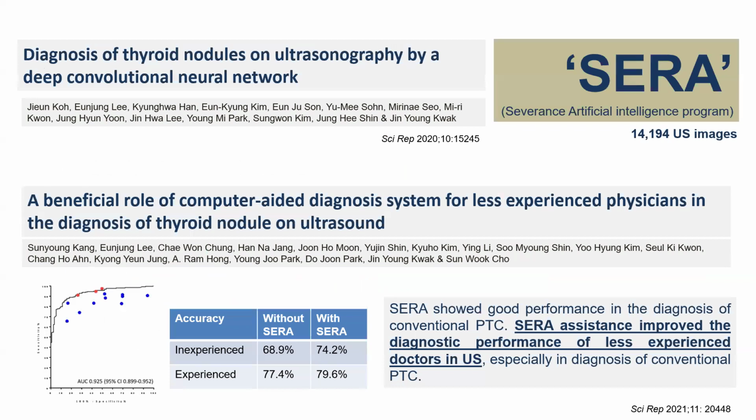My research team developed SERA using about 14,000 ultrasound images in 2020. SERA assistance improved the diagnostic performance of less experienced doctors in ultrasound.